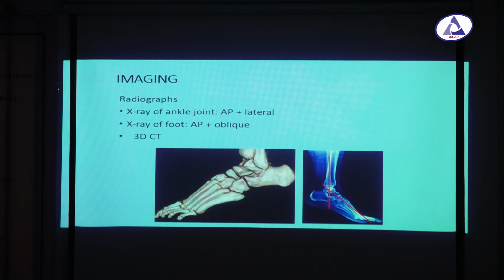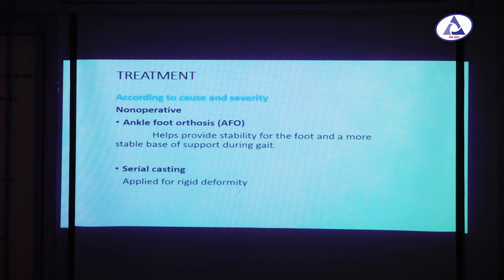And we should do some radiological investigation for searching the cause of this equinus deformity. We can do X-ray, and another is the 3D CT scan, and both of these help us to evaluate or find out any bony or soft tissue pathologies. And now the treatment is mainly based on the cause of this equinus deformity and the severity of the equinus deformity.